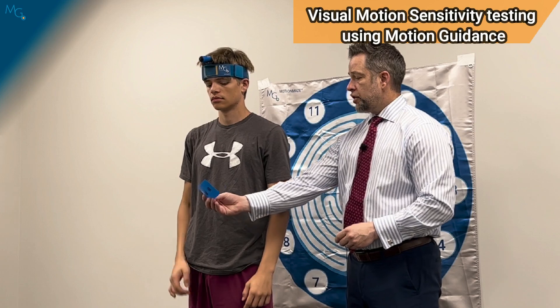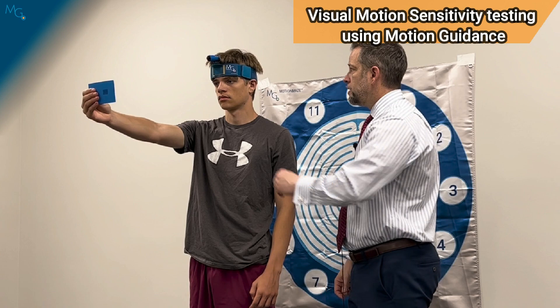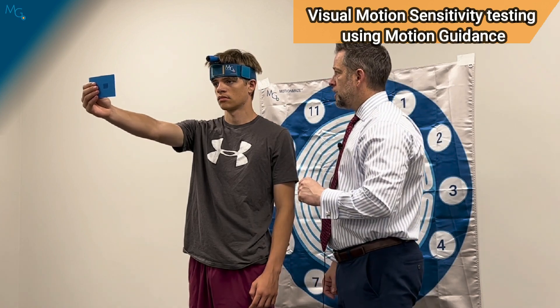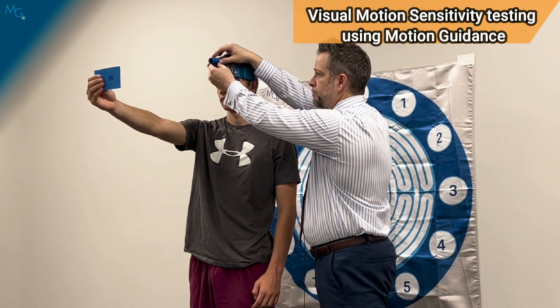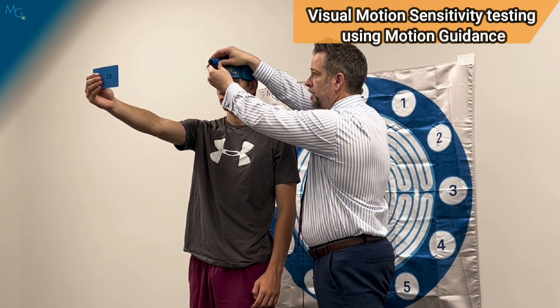Then he's going to hold the card and cover up one of the objects to give him a focus point. Are you looking directly at the object now? So then I can turn on the laser and put the laser onto that area.